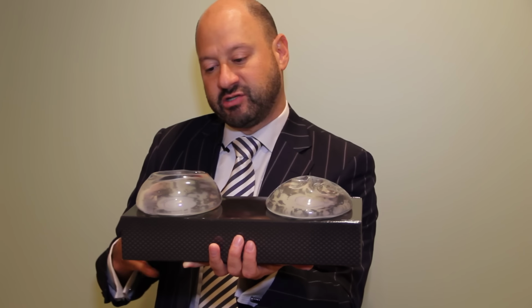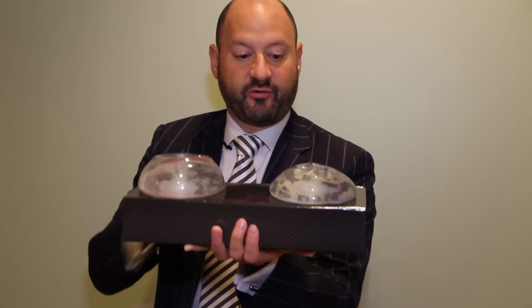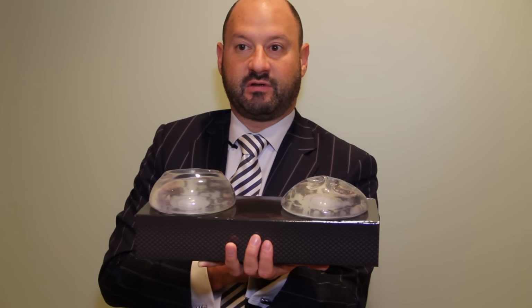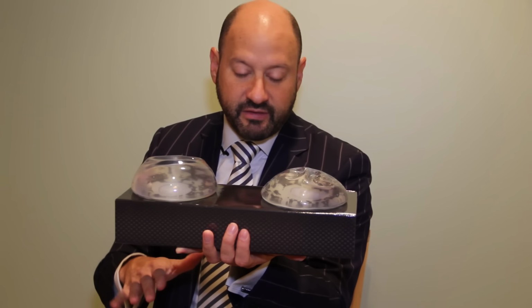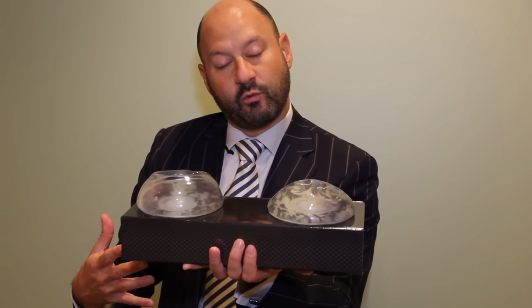And some patients, if they're real wide to start, would prefer this mid-range because it gets a wider breast, so that there's less space between the breasts. Some patients with a very narrow or petite frame would prefer the high profile because it's the right width for their narrow frame and still gives them a size that's big enough for what they want. And there's some patients that are sort of right in the middle and they can do either one, depending on how big they want to go with the breast and what look they want.